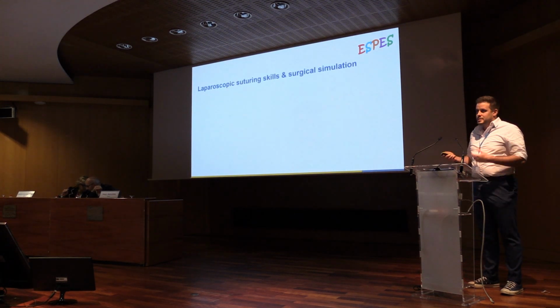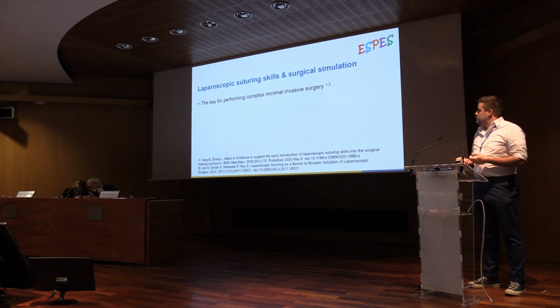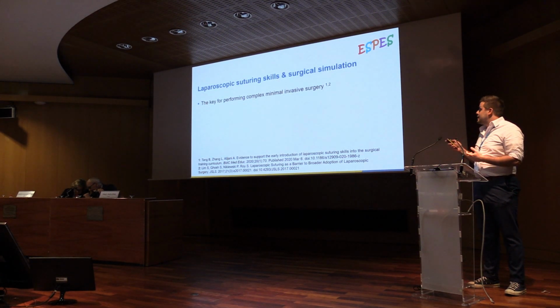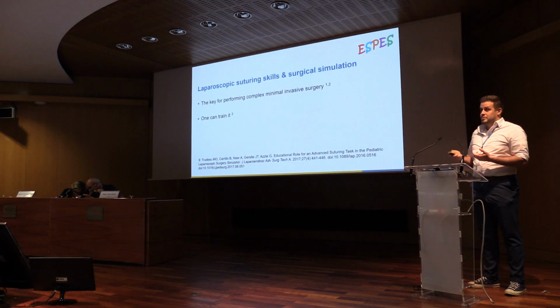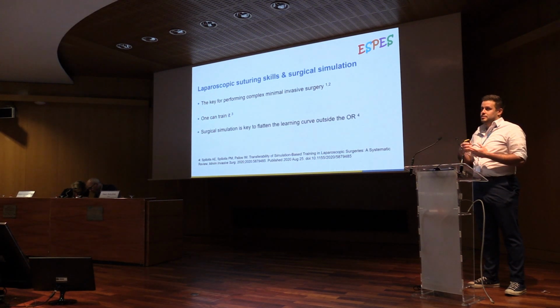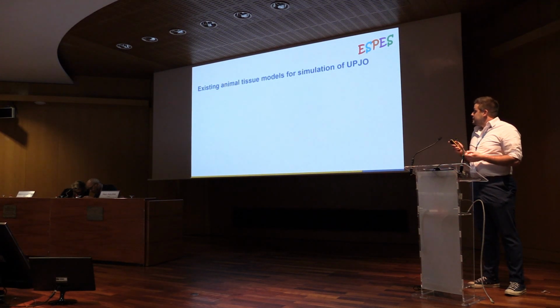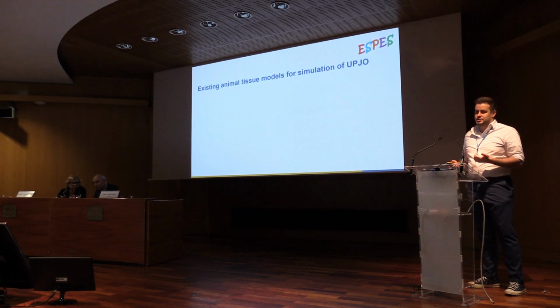First question is why surgical simulation? Some of the talks we heard today and yesterday already gave the answers to that. The key for performing complex minimally invasive surgery is laparoscopic suturing. And as our colleague from Florida showed us, you can train it. All in all, it's very important for patient safety that you flatten the learning curve outside the OR. So there is definitely demand for surgical simulation also of laparoscopic pyeloplasty in children.